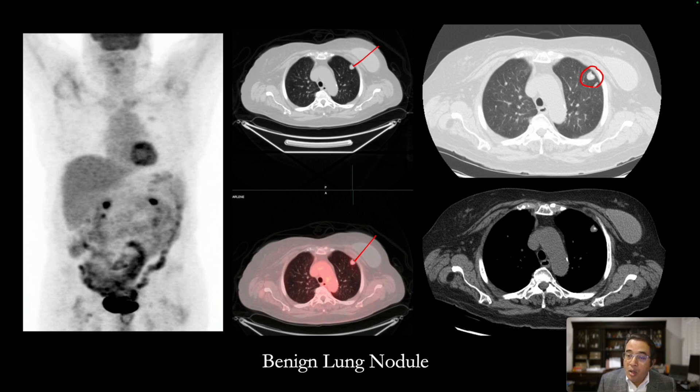The image on the top is in the lung windows. The image at the bottom is in the soft tissue windows, and this exercise of reviewing the nodule in the soft tissue windows is very important because it reveals the pattern of calcification inside the nodule if there is any.